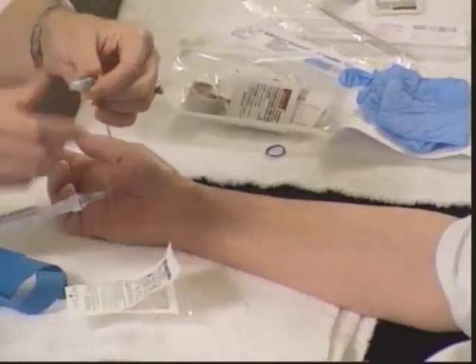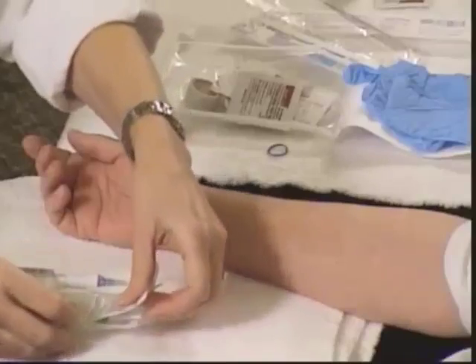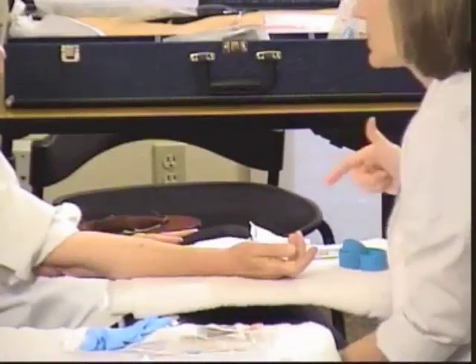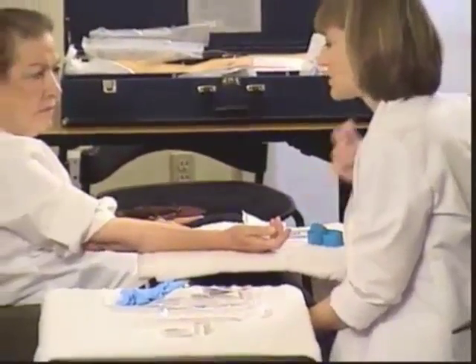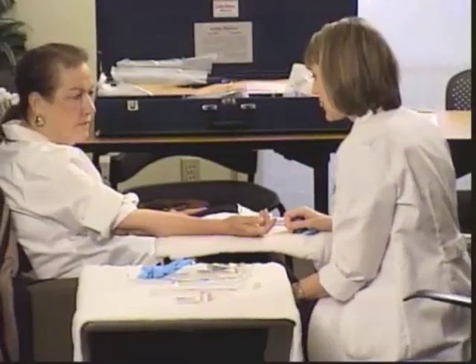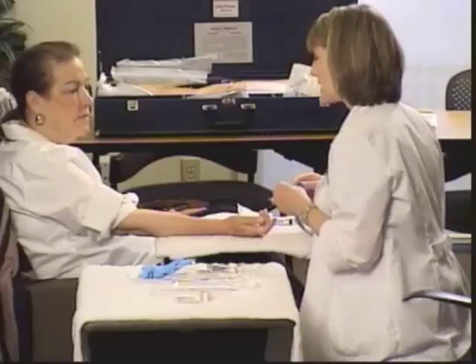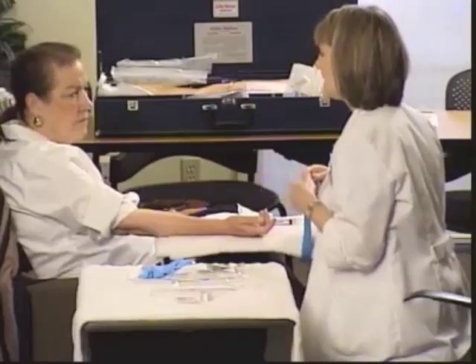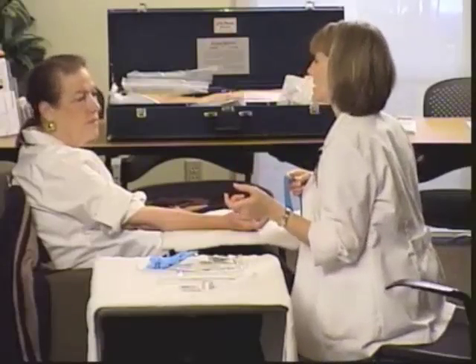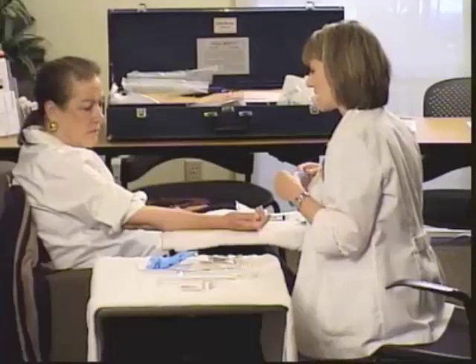I'm going to loosen this cap because when I reach for it later, working one-handed, we'll have it ready to go. That brings up another point: if you want another person in the room helping you, don't be afraid to ask — whether it be another nurse, a CNA, or whoever — especially if it's been a while since you've started an IV. Also, don't forget you want to identify your resident. If they can state their name and date of birth, that's ideal. At a minimum, compare the picture of the resident to the picture in the chart, and make sure you've got orders from the physician.